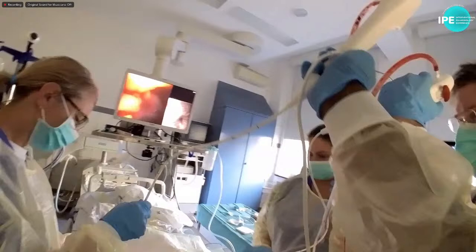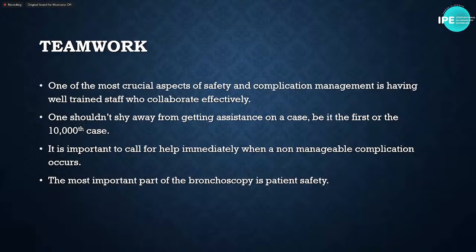It was a patient with tumor in the right upper lobe. I had the colleague doing the tandem debulking, which I'll show later. So I had the security of knowing, even if the bleeding starts, we're still able to stop it, in that I can deal with my biopsy on the right side whilst my colleague deals with the hemostasis. And that's the theme of the last part, which is teamwork.